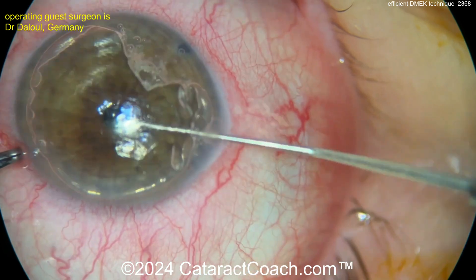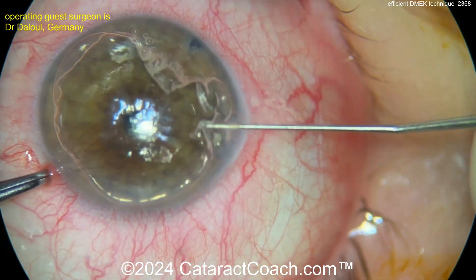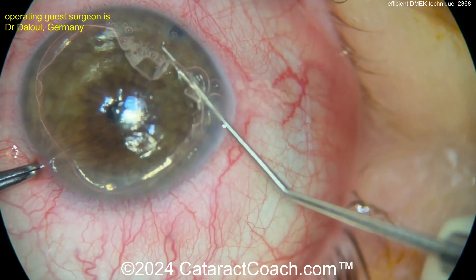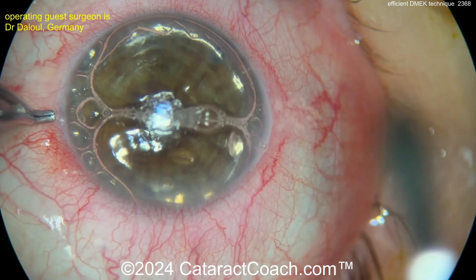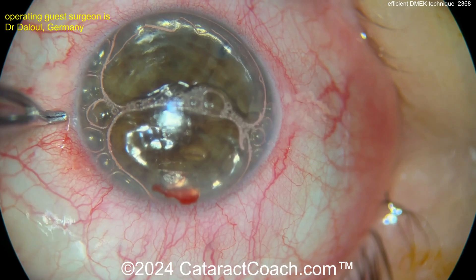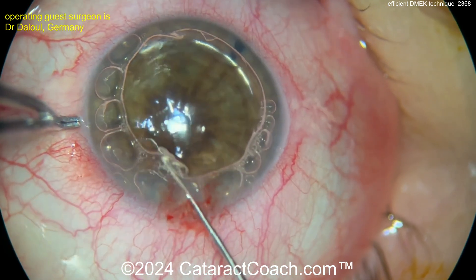Once this is removed, we'll get the new layer into the eye. I learned DMEK by watching videos just like you're watching now. Some of the more important videos for me were Martin Derasimer's technique and also Peter Veldman from Chicago — brilliant surgeons and brilliant techniques. If you go to the CataractCoach.com website, there's a whole section on these and you can learn from the videos that helped teach me.